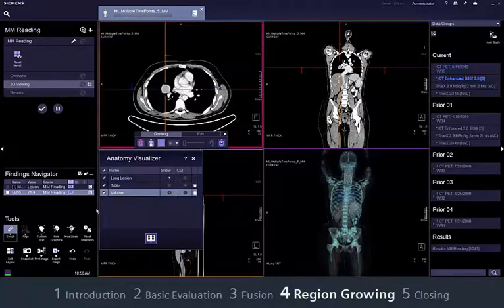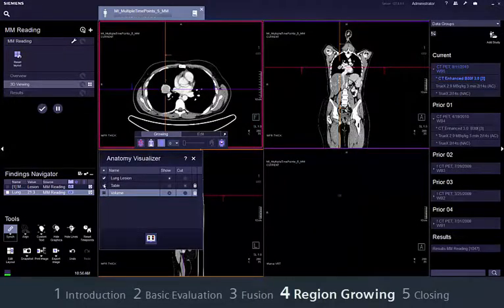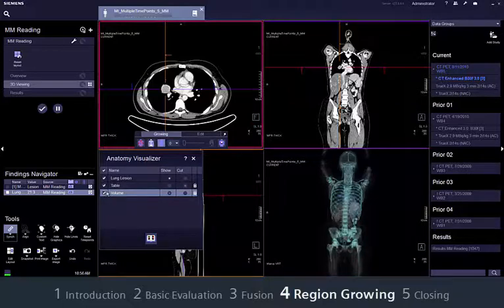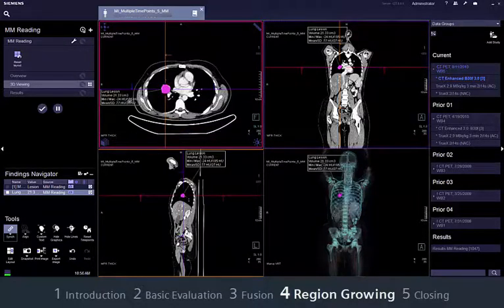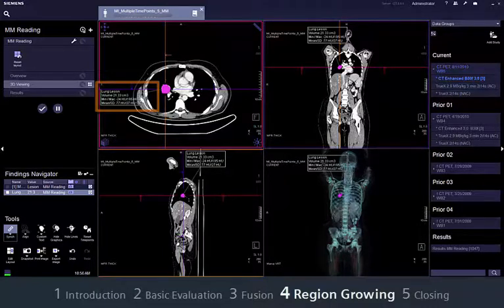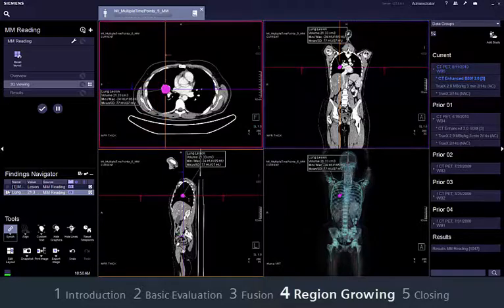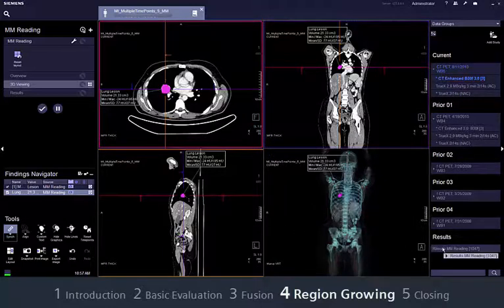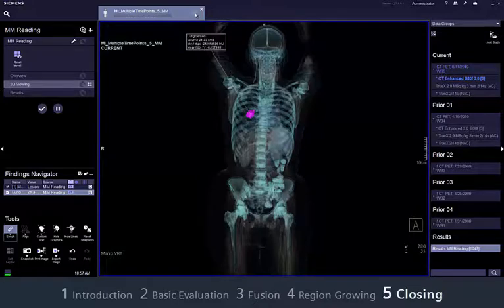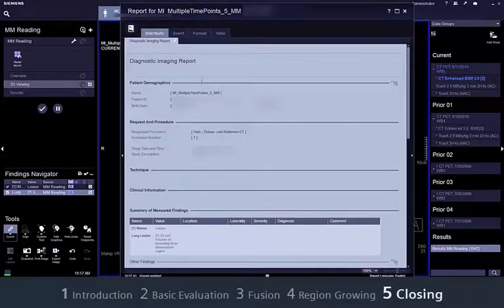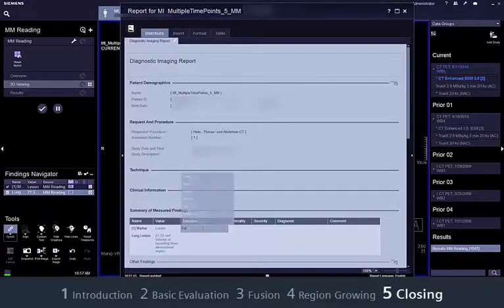Another way to display the lesion only is to cut it out of the entire volume. The volume can be measured and documented as a finding. The volume and the Hounsfield units are measured. The findings are listed in the findings navigator as well as in the results section of the series navigator, and can be exported or printed. If prior datasets are available, you can perform the same volume evaluation on the priors and generate further findings. All marked findings can be sent to a PACS and will be included in the Syngo VIA report.